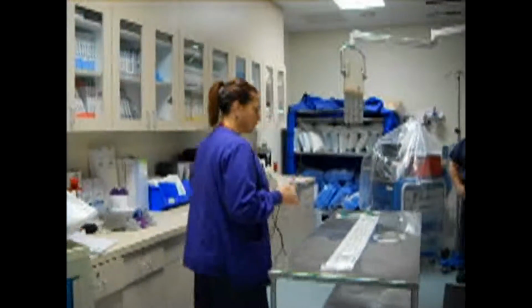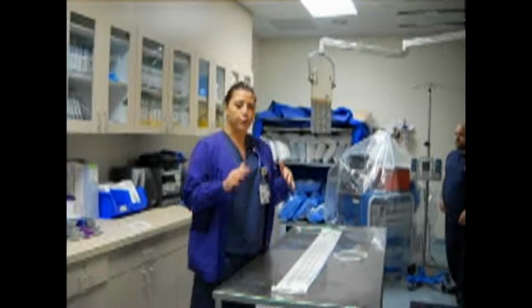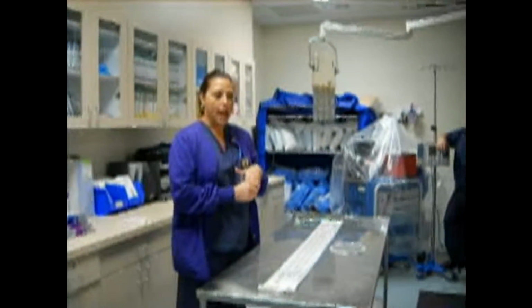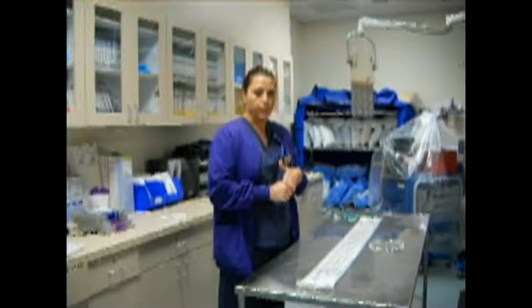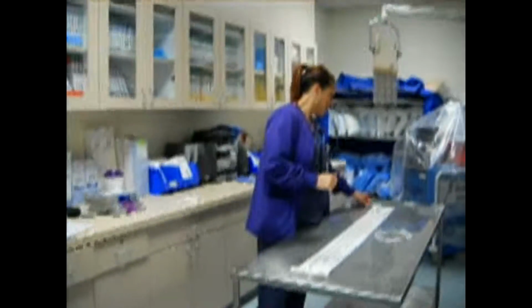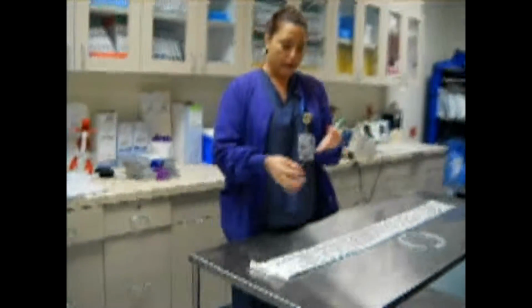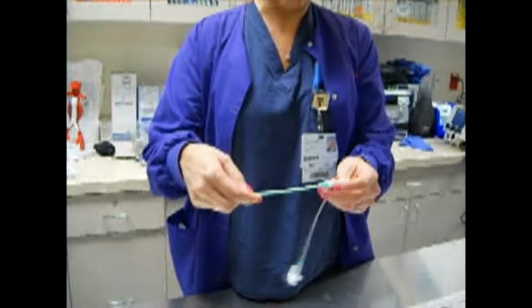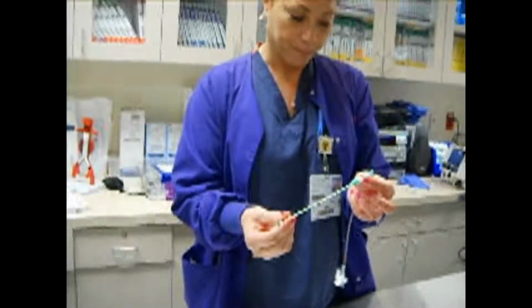Once we prep your skin, we would put a sterile drape over you, and that's when the physician would come in and numb your skin, whether it's in your wrist or your groin. Then he would insert something called a sheath, and this acts sort of like an IV. This is what we advance our wires and our catheters through.